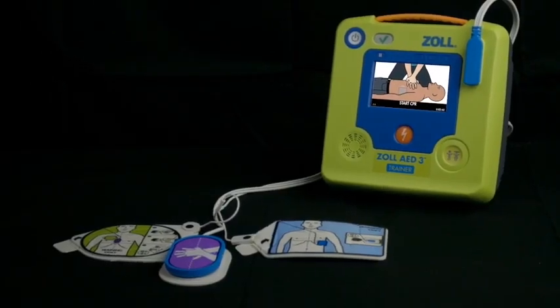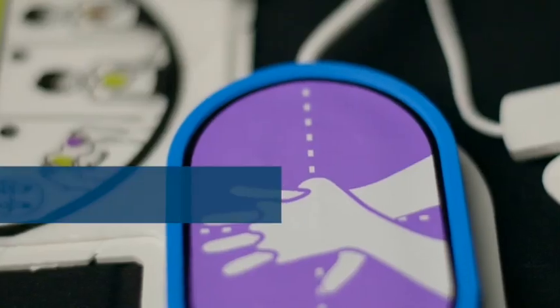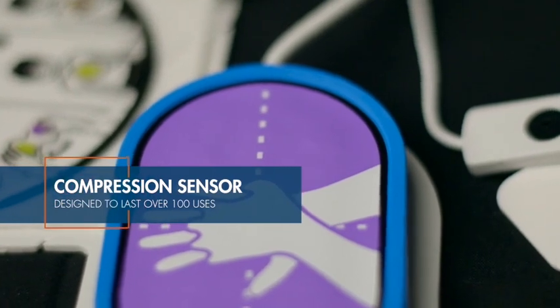Long-lasting training pads. The training gels are designed to last over 50 training uses, and the compression sensor assembly for over 100.